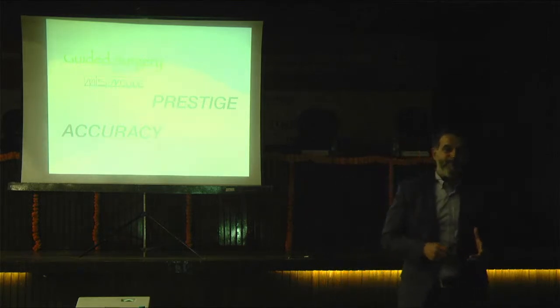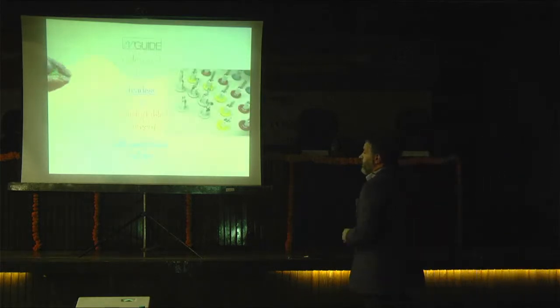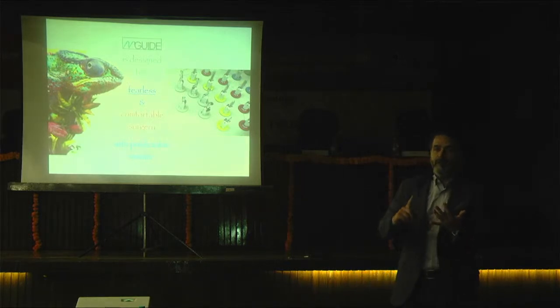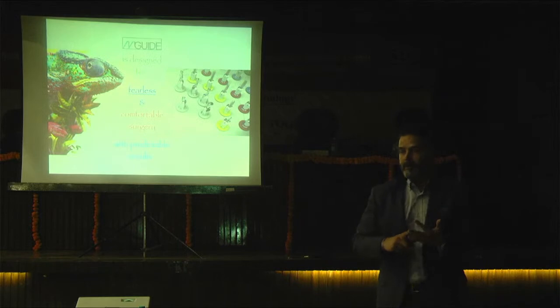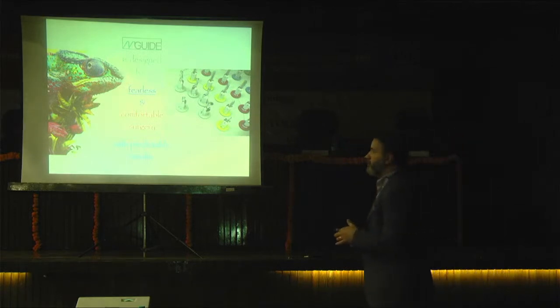It's just like it became a brand. Using M-Guide is something different. So, again, we have so many options about the angulation, the depth, and the right position, good prosthetic predictability, repeatability, short chair side time, and long-term success.